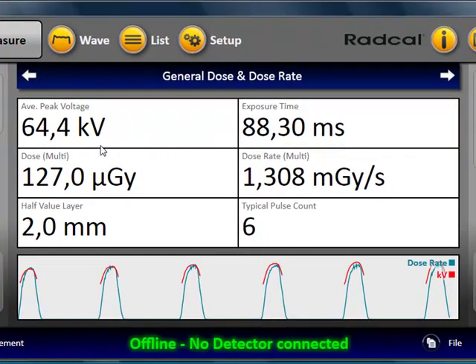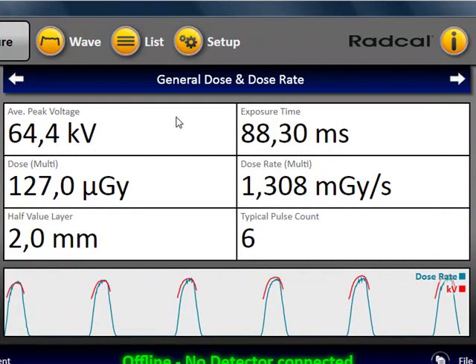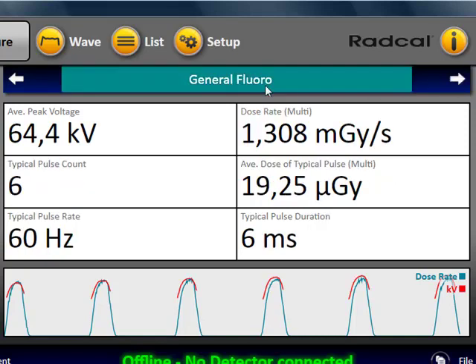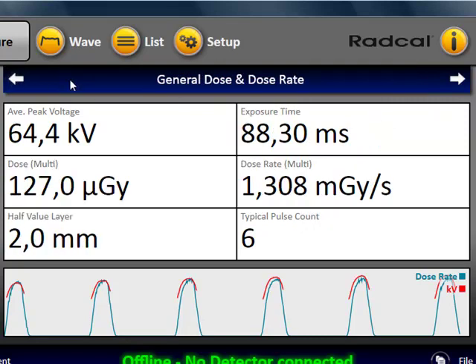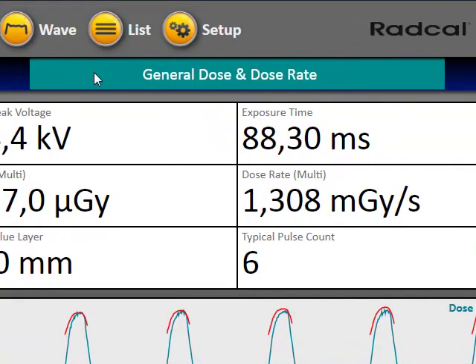Rapidose is able to collect a lot of information about your measurements. In fact, it's more information than we could display at once without losing focus. To be able to keep an eye on what is most important to you, you can filter the data you see by selecting Display Profiles. Display Profiles can be accessed here at the Display Profile bar. You can either navigate through the profiles by using the arrow buttons or by clicking on the profile name to get a list.